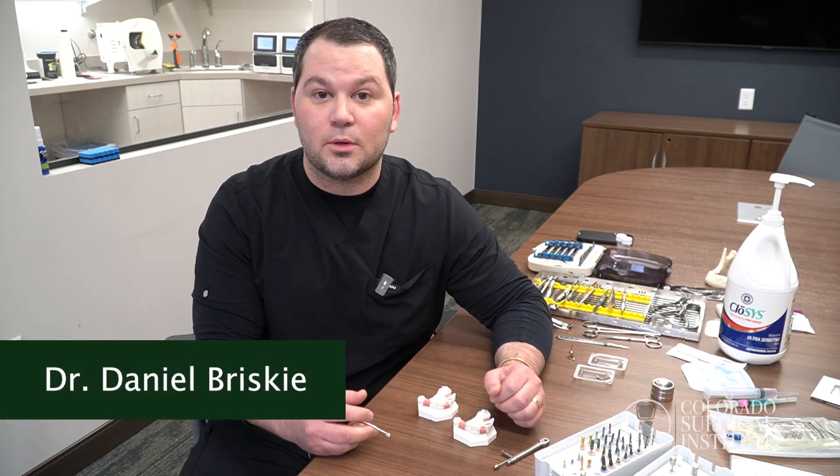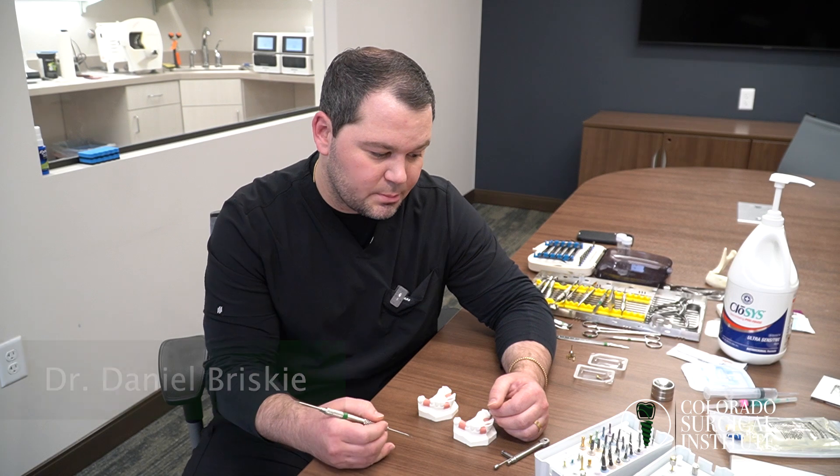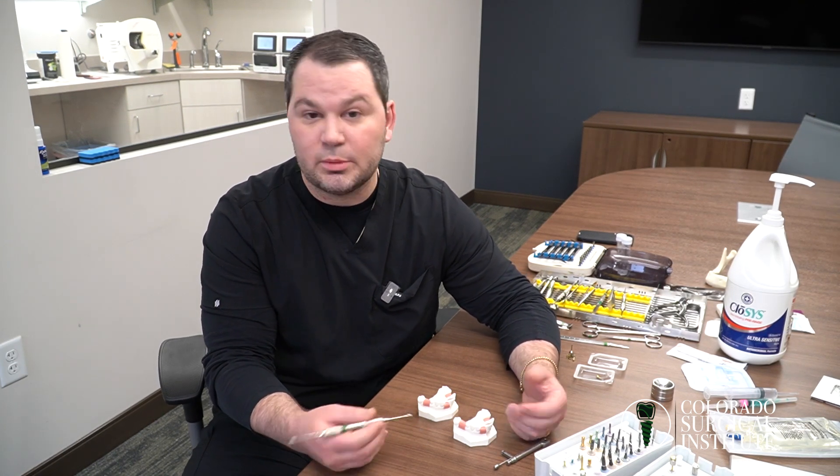Hello everyone, this is Dr. Daniel Briske from Colorado Surgical Institute. Today I want to talk about picking a healing abutment versus a cover screw, and what scenarios would be best for each one.